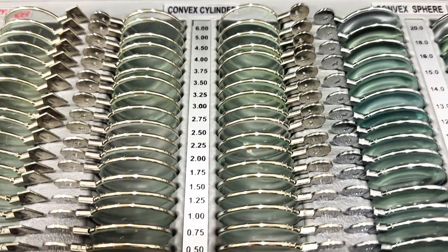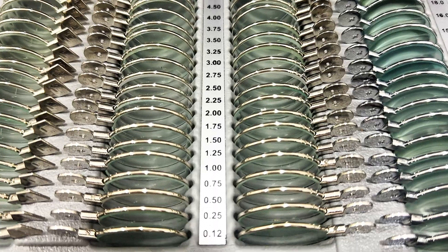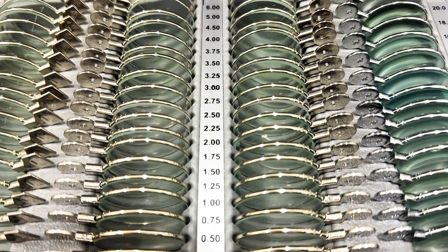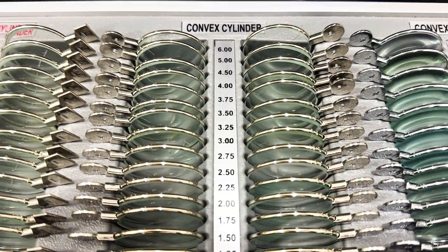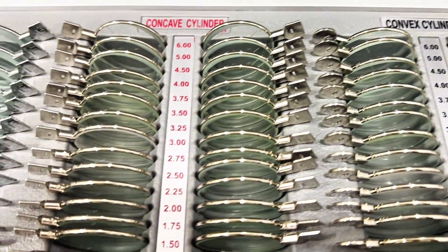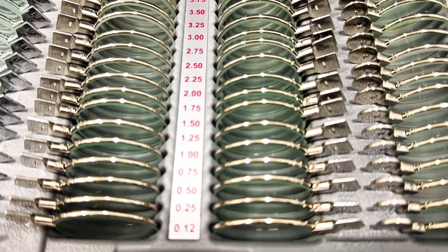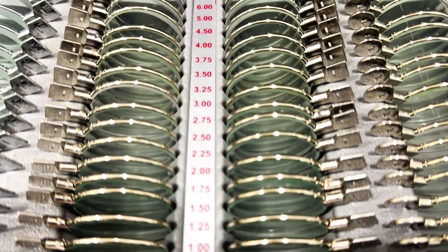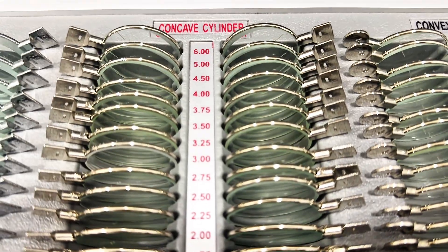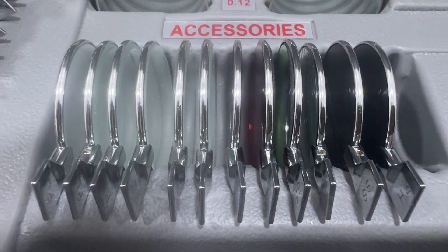We also have the cylindrical lenses. They come in plus and minus forms and they are usually marked with axis indicators.